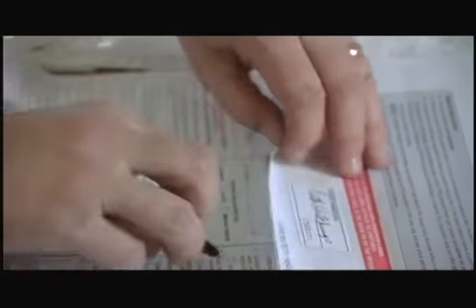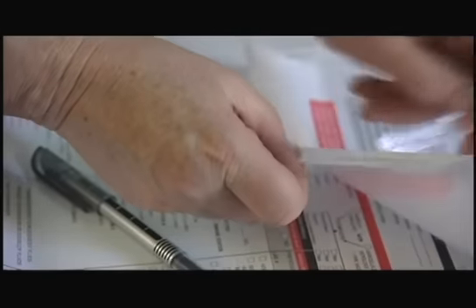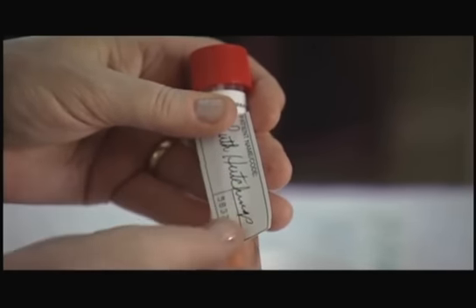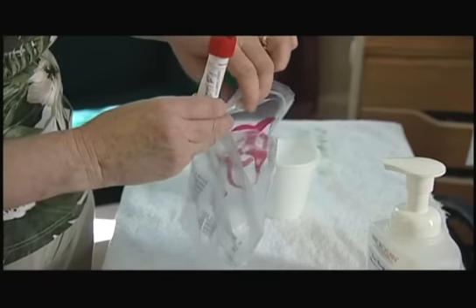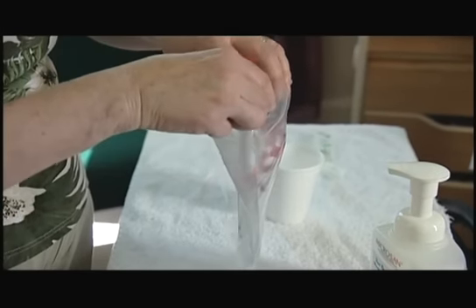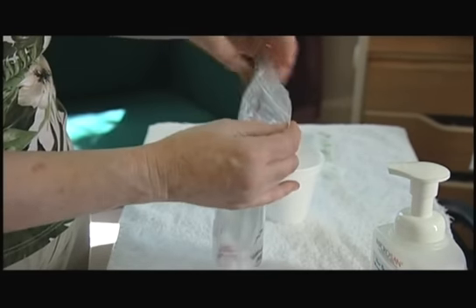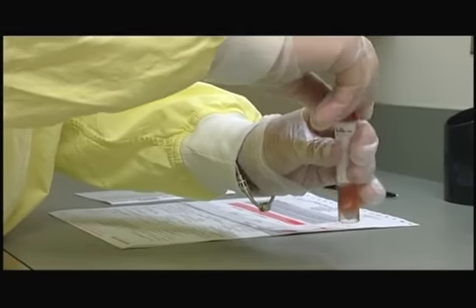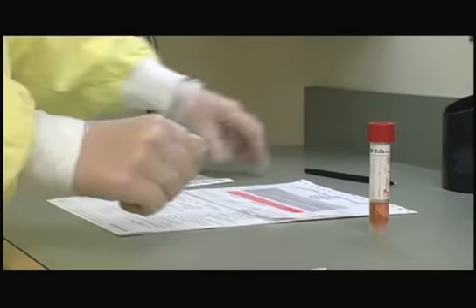Once you've collected the sample, ensure that you've labeled the sample device with at least 2 patient identifiers, specifically the patient name and either the personal health care number or date of birth. In addition, please include the specimen source, such as nasopharyngeal or throat swab.